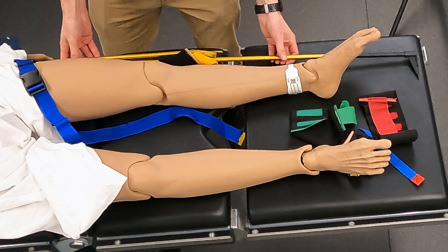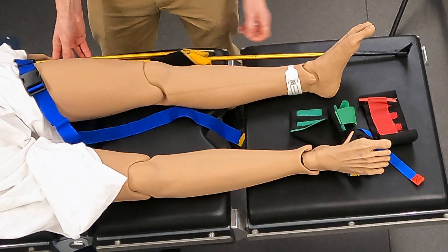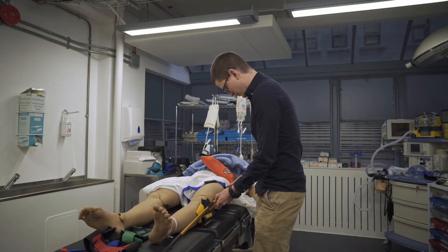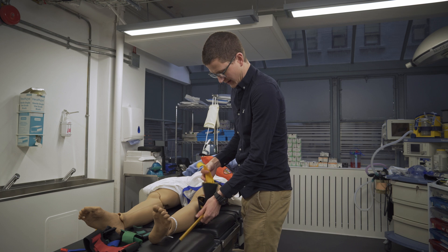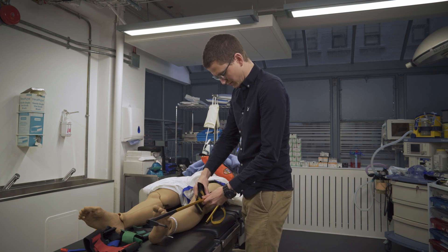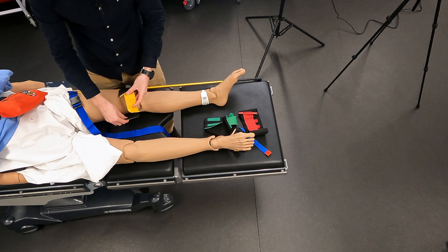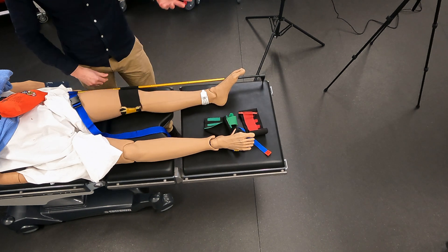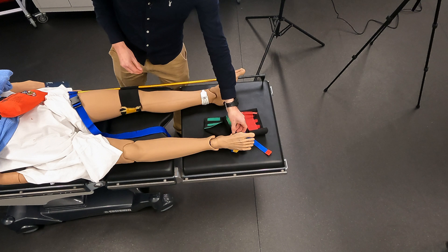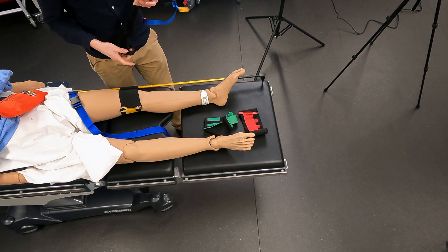We're going to go with that size. We push that into the groin strap, and then this yellow tag — the only tag attached to the poles — is attached above the knee. The purpose of this strap is to keep the pole next to the leg. Once that's been attached, we are then going to attach the ankle strap.